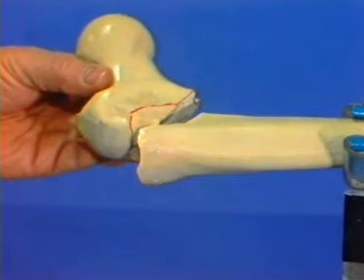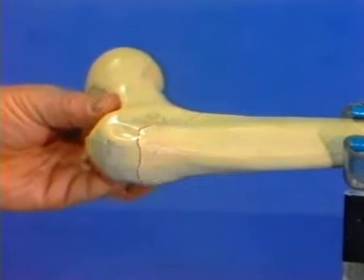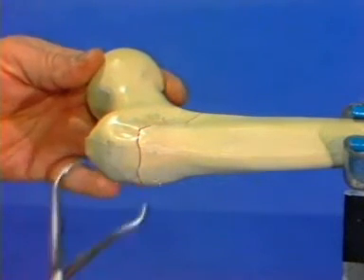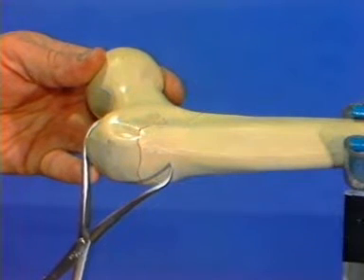Now using the model, we will demonstrate the proper use step by step. First, we reduce the fracture. Since soft tissues are absent in our exercise, we begin by fixing the fracture with a pointed reduction forceps.